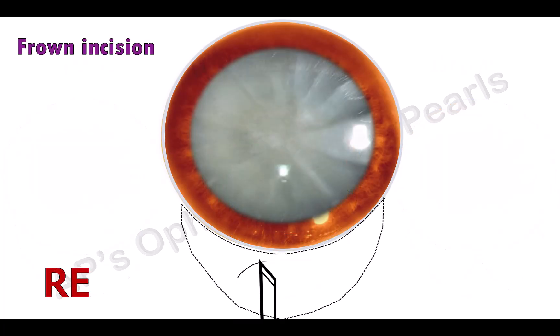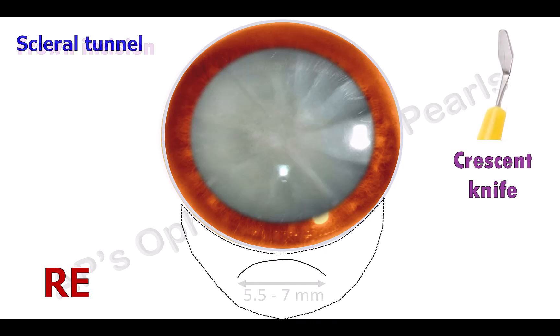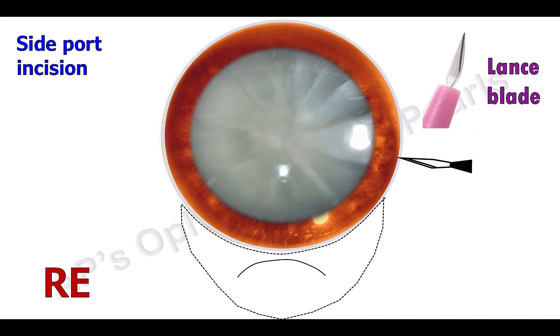Here, a frown incision is made with a number 15 blade or a razor blade fragment. A crescent knife is then used to dissect a scleral tunnel to about 1.5 mm into clear cornea — that is the second plane of the triplanar incision. The internal width of the tunnel should be greater than that of the external width. A side port incision, useful for extra maneuverability and for easy removal of sub-incisional cortex, is made with a lance blade.